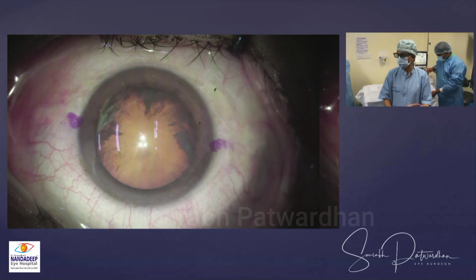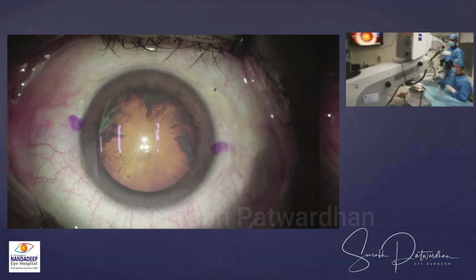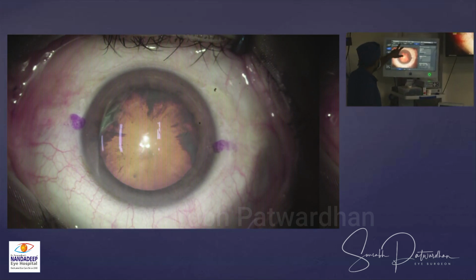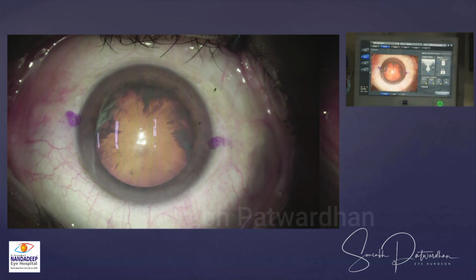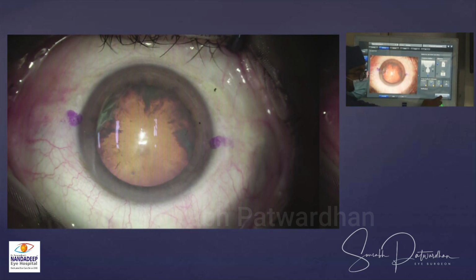Can you just show the camera on the Callisto also? There you can see that we have registered. We can show the registration part again. Just register as an executor. So now you can see the eye is getting registered there. Start registering.